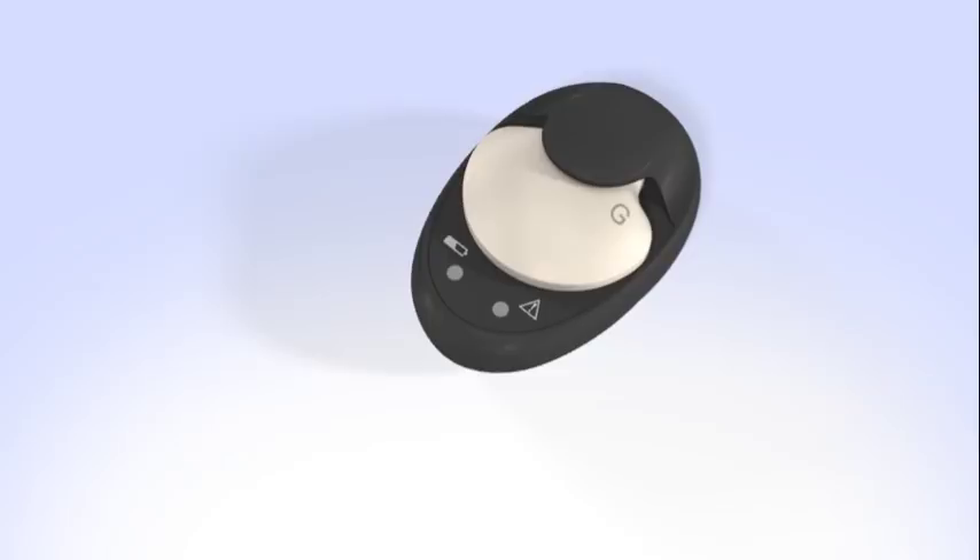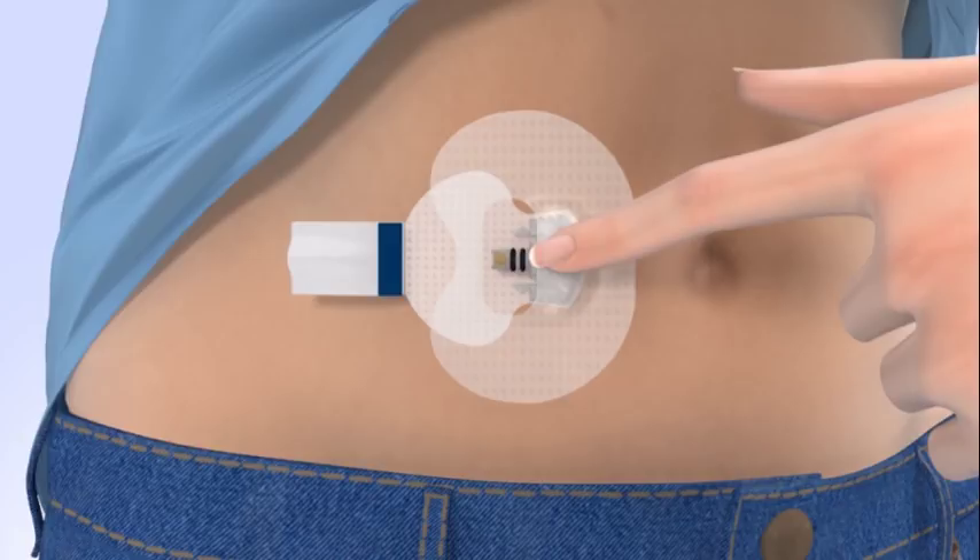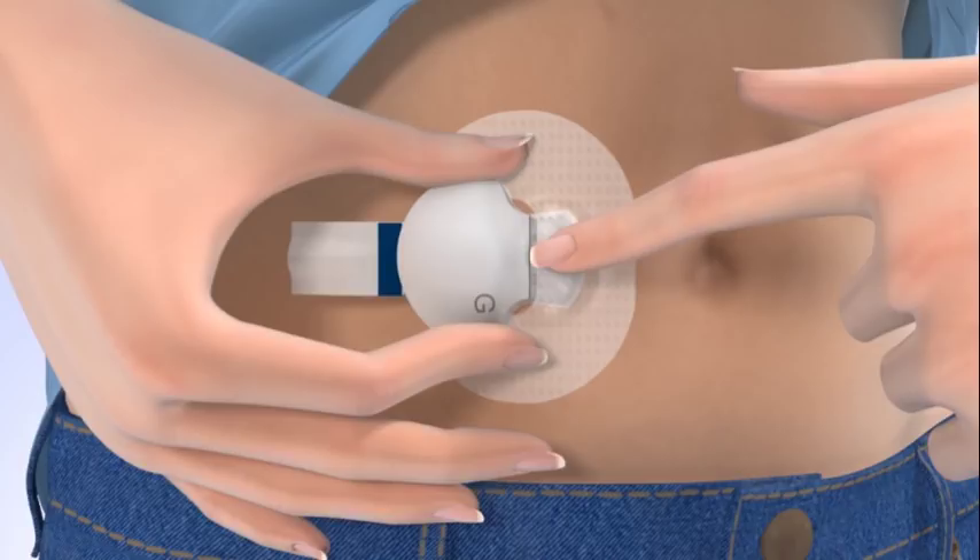To connect the transmitter to your sensor, remove your transmitter from the charger and watch for the green light to flash. With one hand, hold the sensor in place. Hold the transmitter with your other hand and push it onto the sensor. It will click when it is connected.